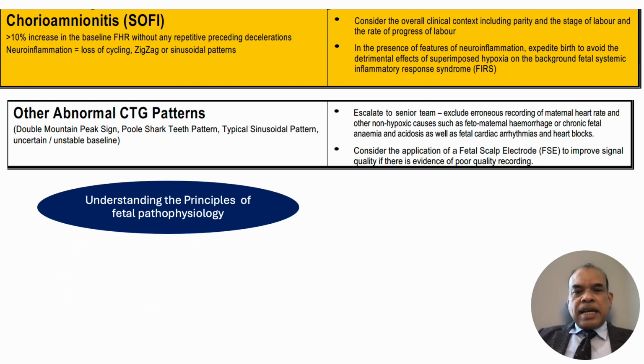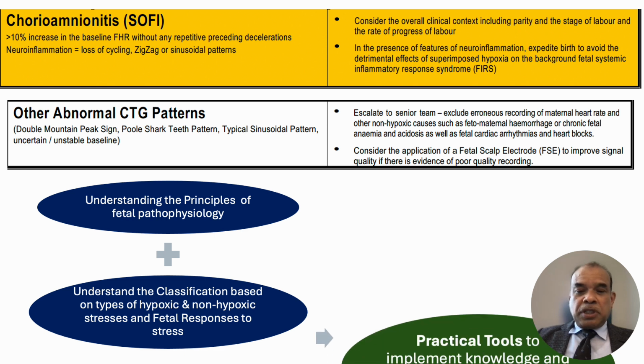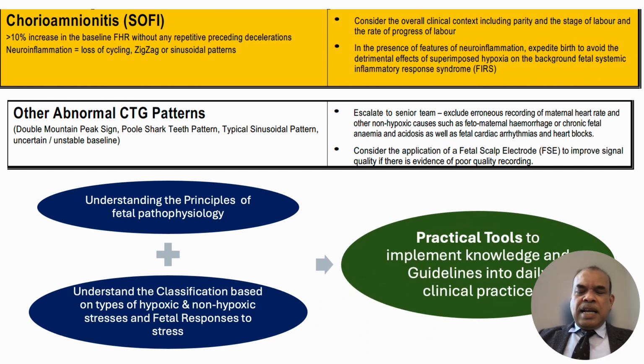So once we understand the principles of pathophysiology and understand the classifications which have been recommended to identify different types of hypoxia and other non-hypoxic causes of fetal compromise, then it is logical that the next issue is to develop practical tools to help frontline midwives, nurses, and obstetricians to implement these guidelines in their daily clinical practice.